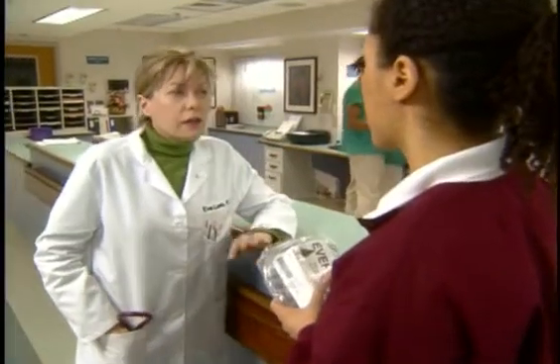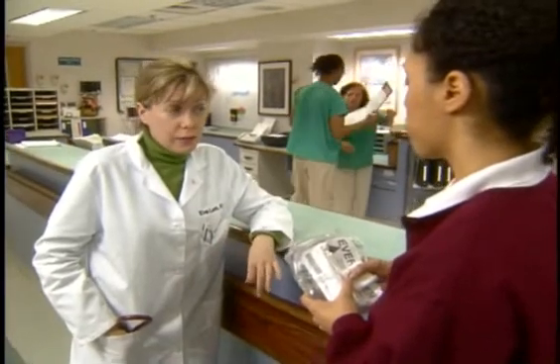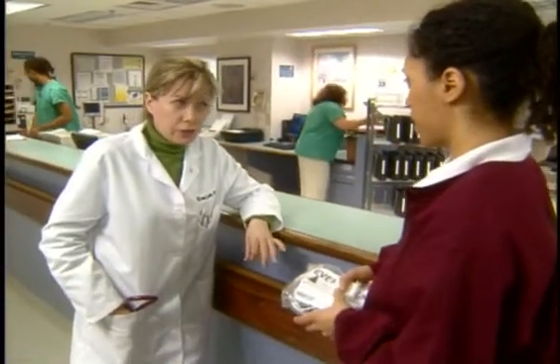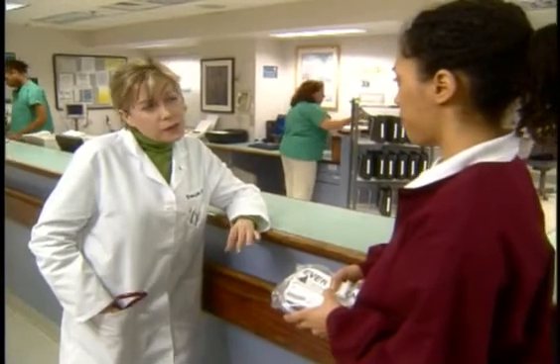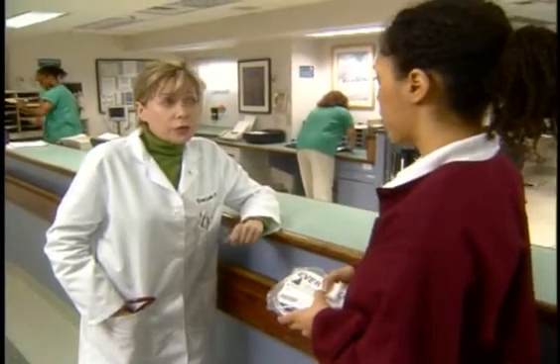Okay, that's fine. When you're putting it on, it's important to make sure that the mask fits snugly around the patient's face. If it's loose, it will not effectively deliver the right amount of oxygen. Right. And be aware of meal times because the patient can't eat with a mask on. Exactly. So there should be an order for oxygen via nasal cannula during meals. But because the amount of oxygen with the cannula will be less than the mask, return to the mask immediately after his meal. Okay, should we go? Yeah, let's.